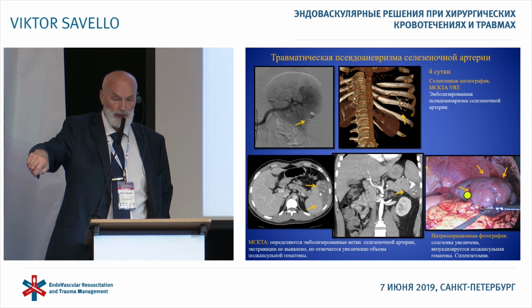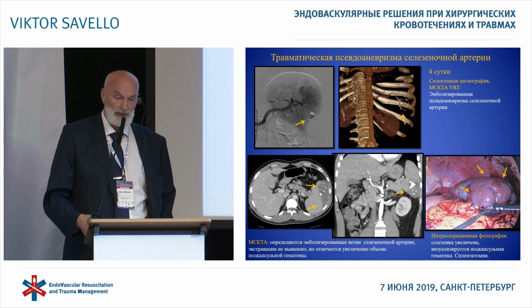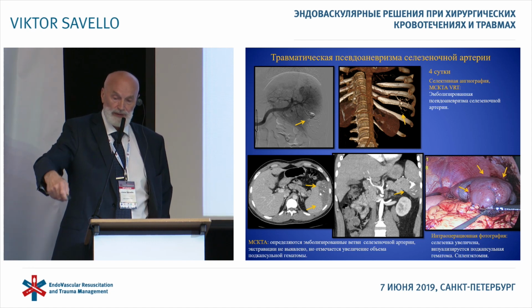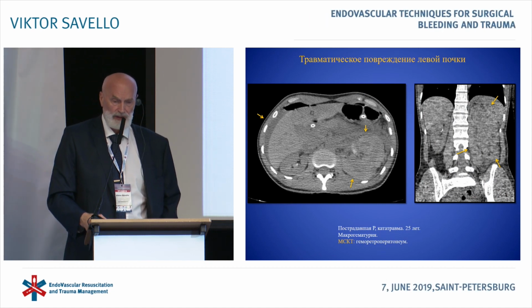During laparotomy, we can visualize here the spleen. It's large in size, and we can see a big subcapsular hematoma. Because of the inefficiency of the treatment, it was decided to do splenectomy, and in this case, it's only the CT that helps you to assess the result, predict the complications, and make the right decision on the strategy of treatment.